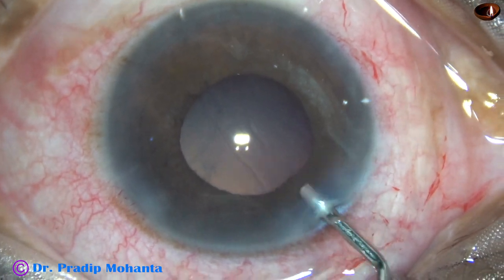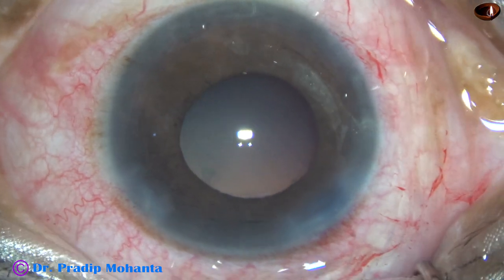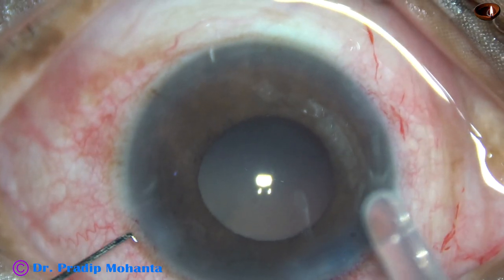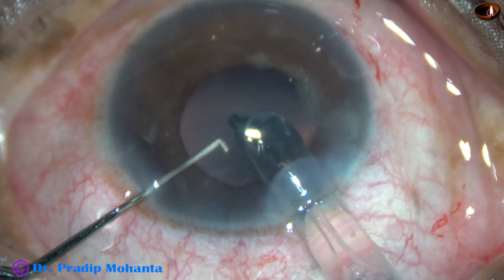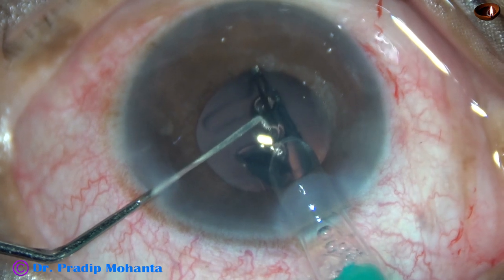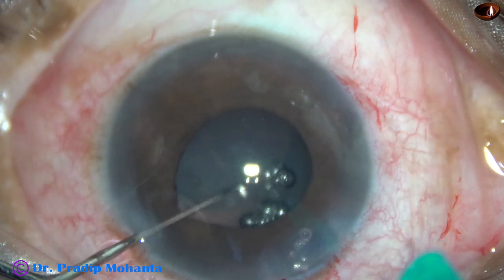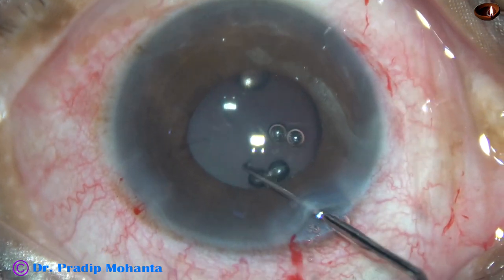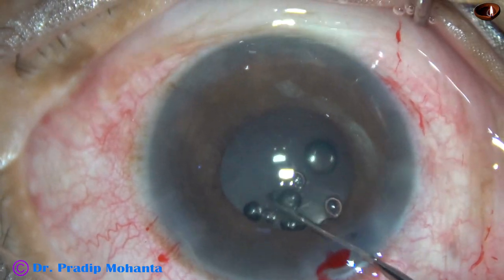2% HPMC viscoelastic is injected to fill the capsular bag as well as the anterior chamber, and then a hydrophilic acrylic single-piece monofocal intraocular lens is being implanted in the capsular bag. The main incision has been enlarged a little bit, which has not been shown. The lens is delivered slowly and goes into the capsular bag, and is then dialed into position.